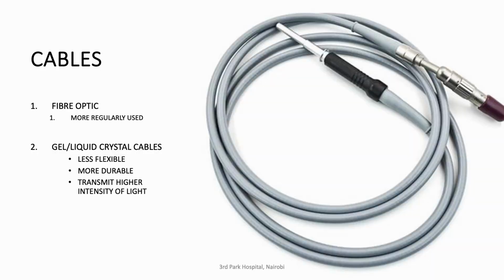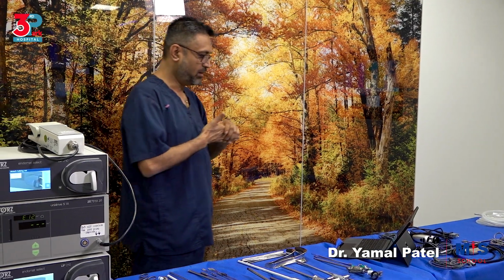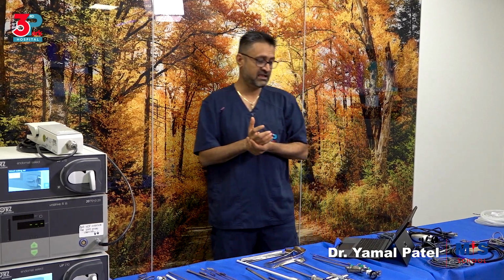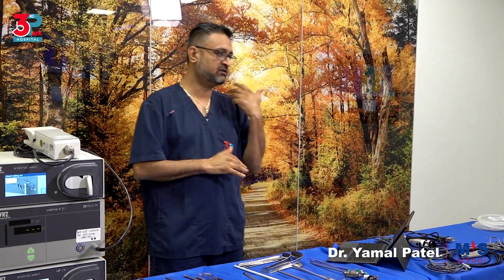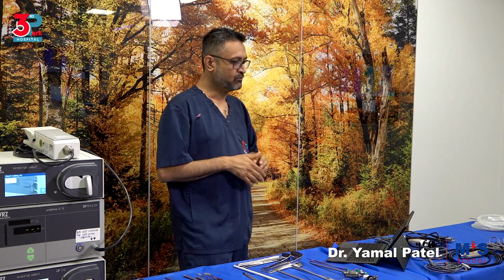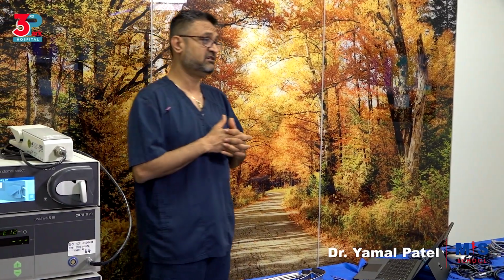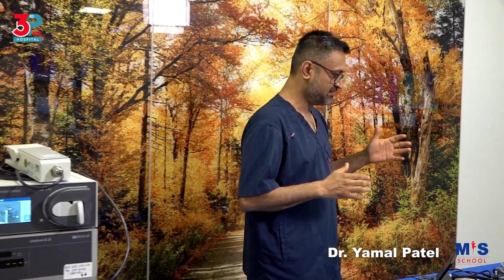The cables, we have either fiber optic cables like this one, which is the most regularly used cables. And then we have the liquid crystal or gel cables, which are less flexible. They are a bit durable as well, and they do transmit higher intensity of light. But the problem with those is, one, they are a bit more expensive, and two, they are not easily available.